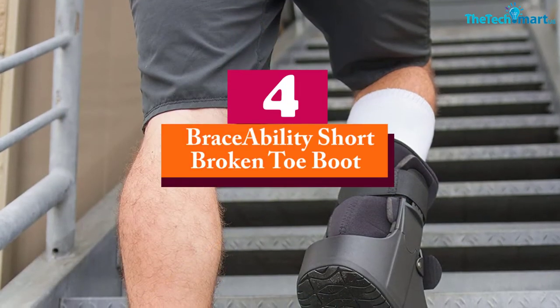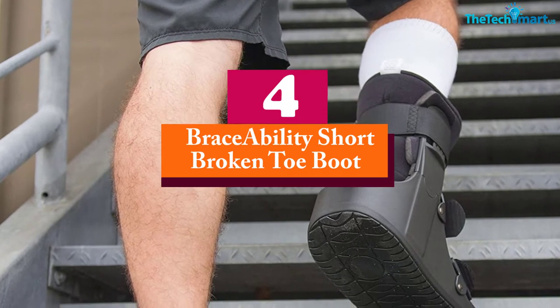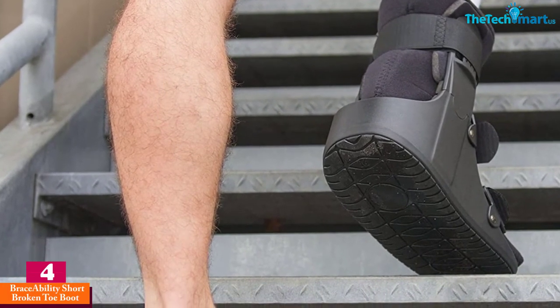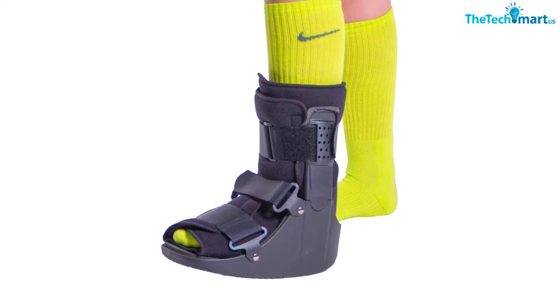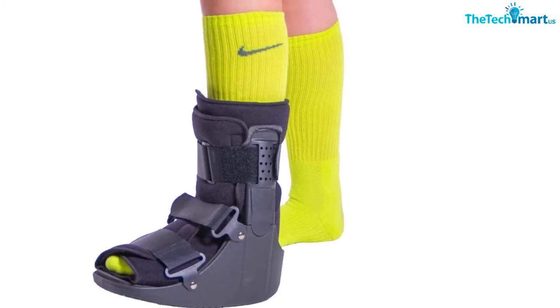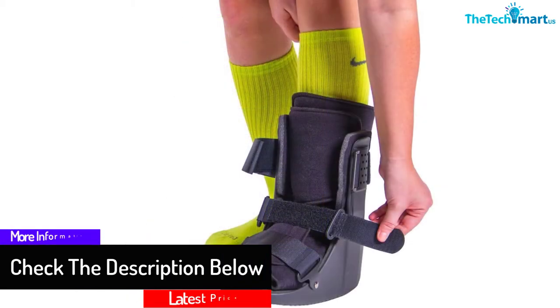Moving on at number 4, we have the Braceability Short Broken Toe Boot. This cam walker boot has a durable, hard yet firm polyester plastic shell. Therefore, this shell offers enough stability to your foot and ankle from every angle. Moreover, the universal fit design makes it suitable for most people, and the low-profile rocker bottom helps you to take a natural step without hurting your injured leg.